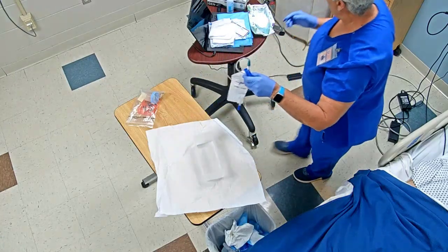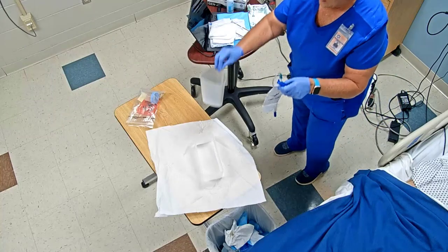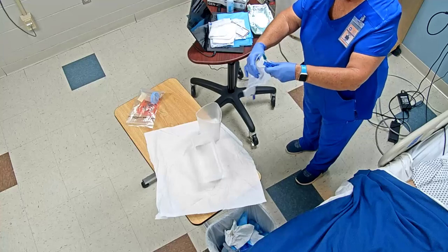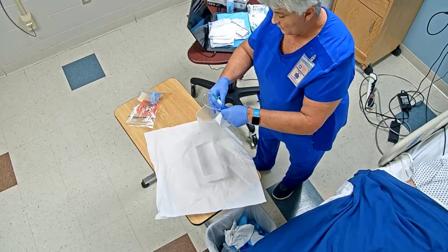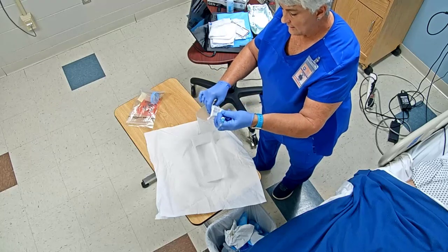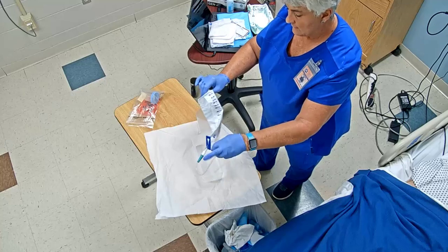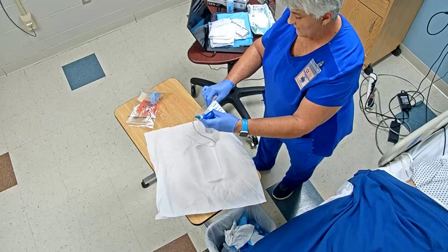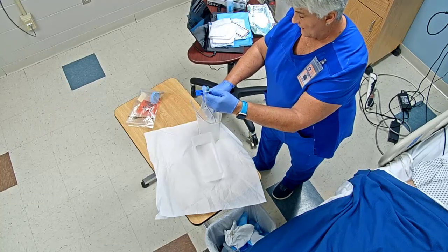Okay, and so I'm in the bathroom, and I would have this, and I'm going to go ahead and open it, hold it over the toilet, and clamp it. Get my hand, so we don't have that catheter going everywhere. Okay, and we're going to go ahead and drain everything in there.